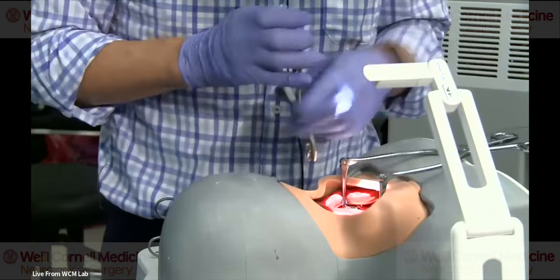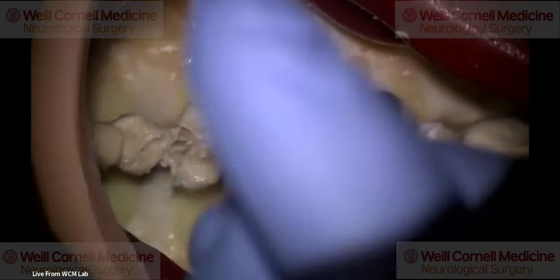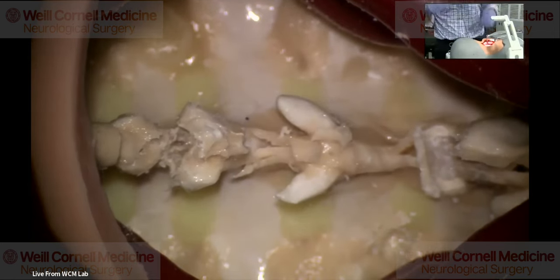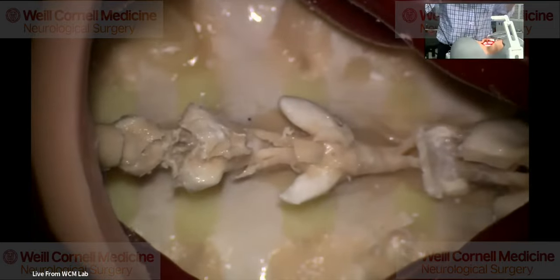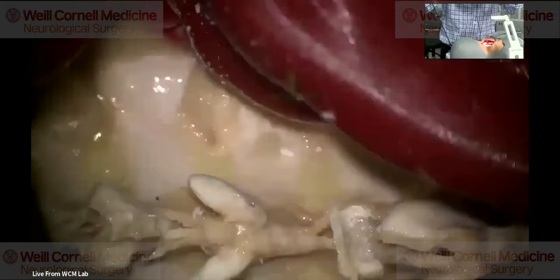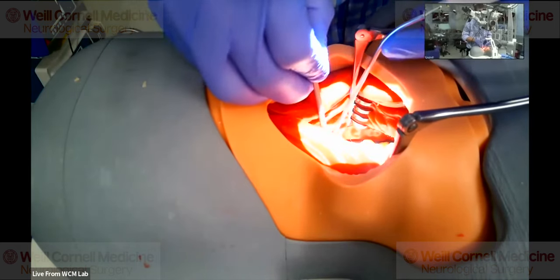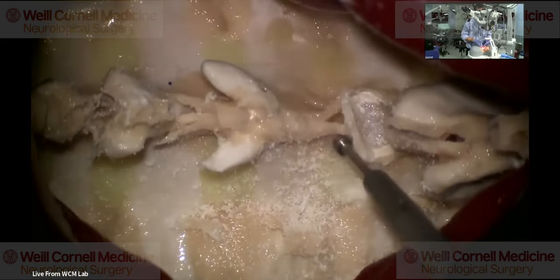So the first thing I do is do a laminectomy of C3. And that's pretty quick. You can either piecemeal it or you can just take the burr and burr it down. And I usually do something like that. And then I go right to the burr. And basically you find the ligamentum flavum and you stay on the ligamentum flavum and you just keep burring. Now, if you don't have compression at C2-3, you don't have to go all the way up to the C2-3. Here's the ligamentum flavum. So I just take the burr and use that as my protector and just grind away.